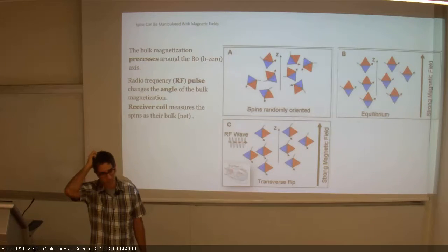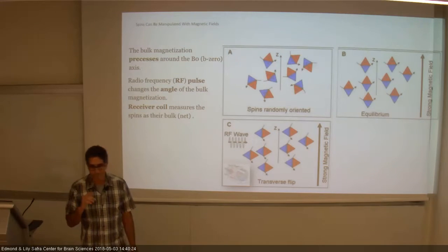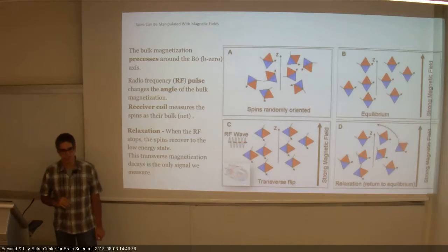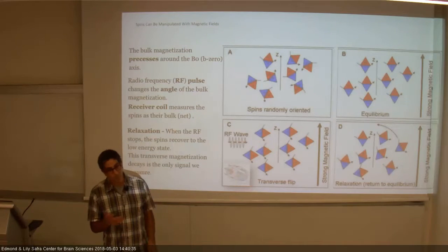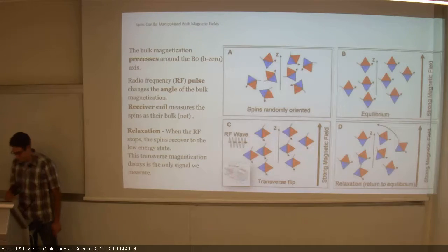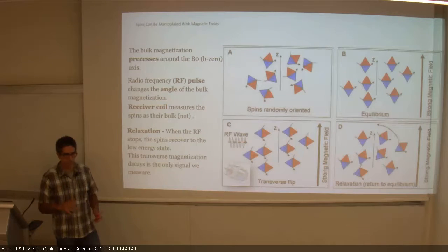It will take some time, in the order of seconds, but they will all go back. Do we measure only the relaxation or also the excitation? We measure only the relaxation. There is more than one relaxation, and I'm not going to dwell on that now. But we're measuring only the relaxation. You cannot measure during the excitation. The system measures after.